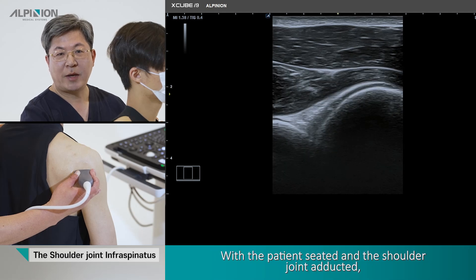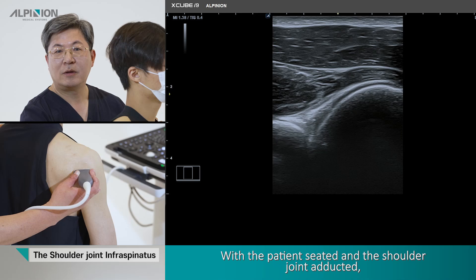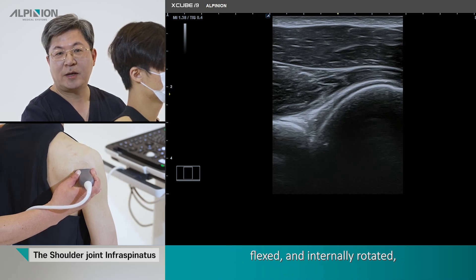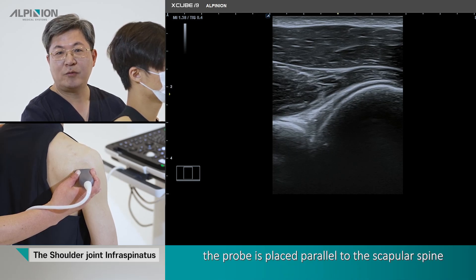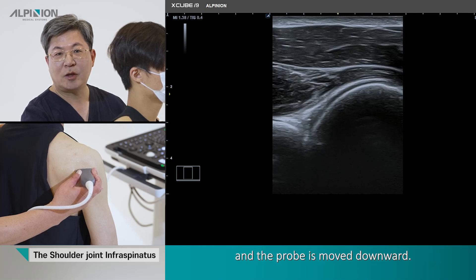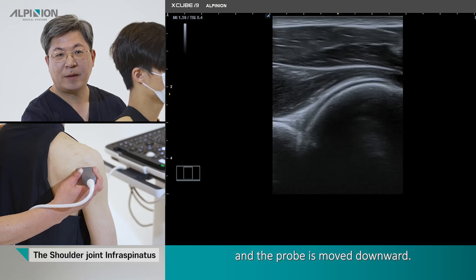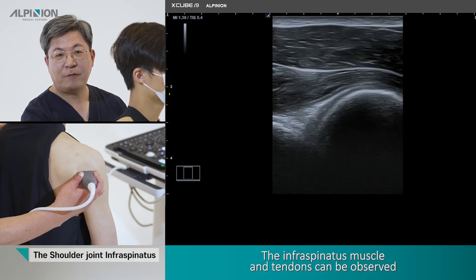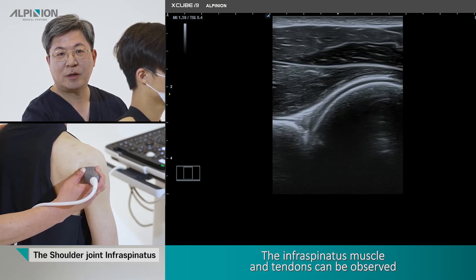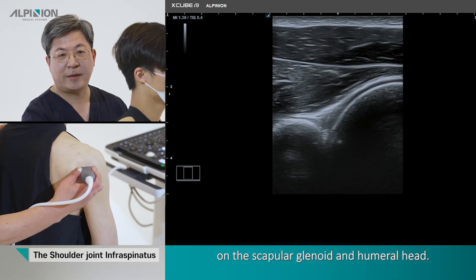With the patient seated and the shoulder joint adducted, flexed, and internally rotated, the probe is placed parallel to the scapula spine and moved downward. The infraspinatus muscle and tendon can be observed on the scapula glenoid and the humeral head.